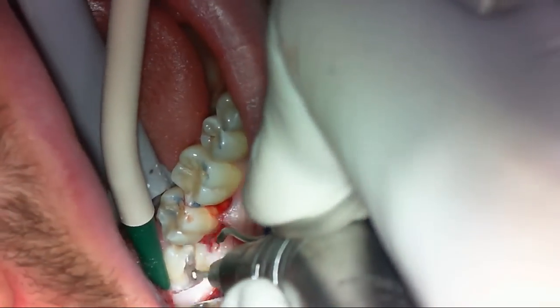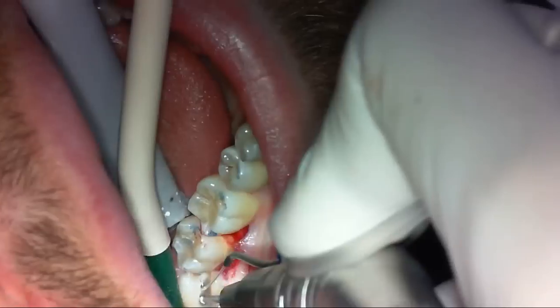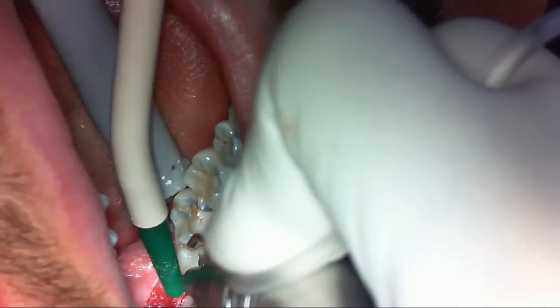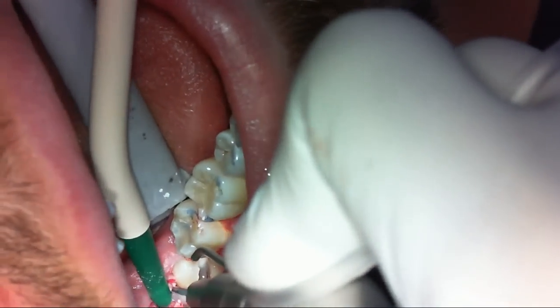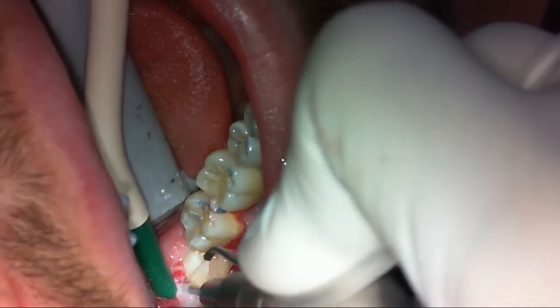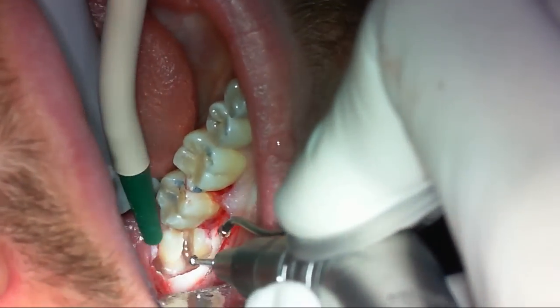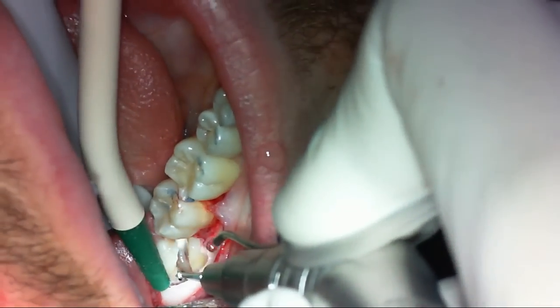It's very important to protect the soft tissue and the lip — especially if the patient is under general anesthetic, it's very easy to burn the patient's lip. Always rest your handpiece on your retractor. Now I'm doing a little more tunneling on the distal and extending my section a little more apically as well.